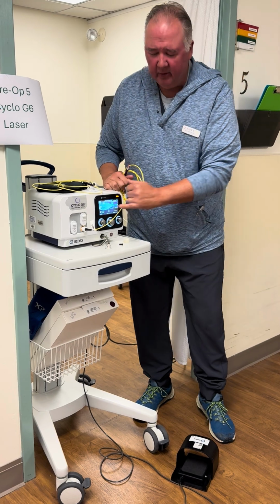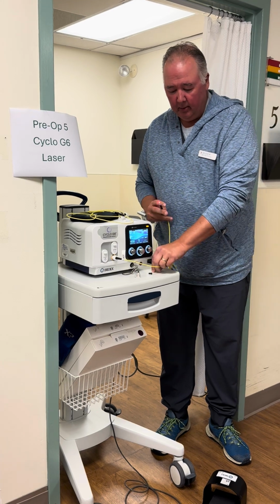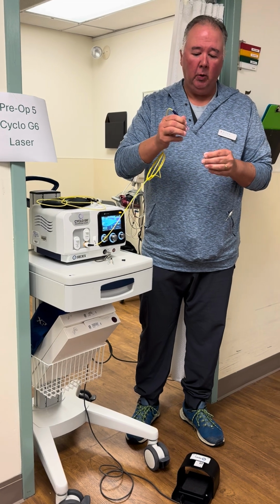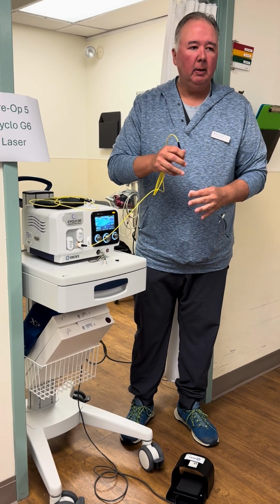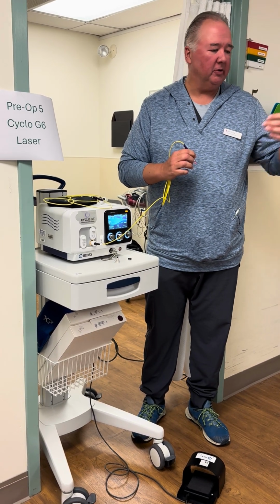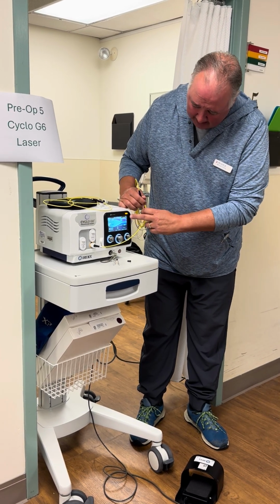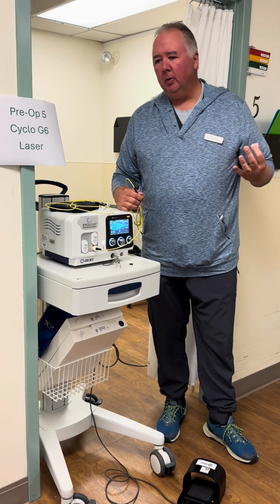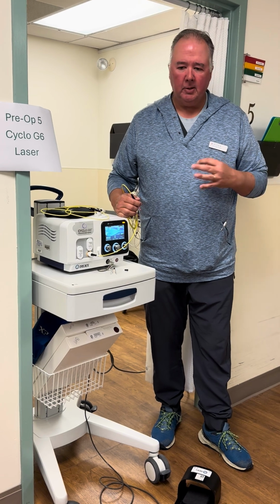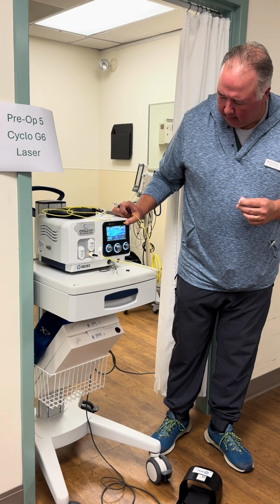So what this is doing is it's treating for 4 seconds. The difference between this one and the micropulse, where it's sweeping the probe across, is that this is essentially just holding it in one spot. And they hit the pedal, and for 4 seconds, it's coagulating the tissue about 2 millimeters below the surface of the eye. You always want to reset this button here, because that counts how many spots. The doctor's probably going to do anywhere from 18 to 21 spots per patient, somewhere in the neighborhood of 5 per quadrant. So let's give this a shot.